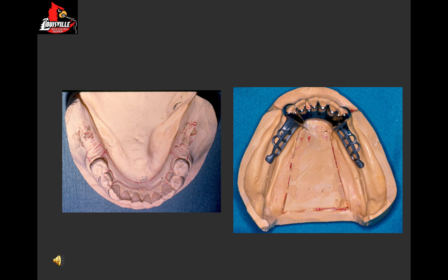The two slides above show the difference between the anatomic form and the functional form. The one on the left shows the anatomic form, which is taken with a regular alginate impression in a stock tray. The one on the right displays a ridge in its functional form. Can you see the difference in the two ridges? Unfortunately, these are not the same patient. I wish I had a picture of one in the anatomic form and functional form on the same patient. It would be easier to see that there is a difference in the way those ridges look under pressure.